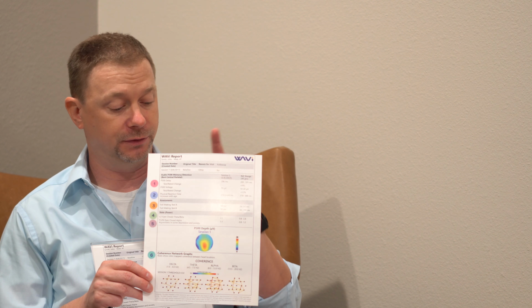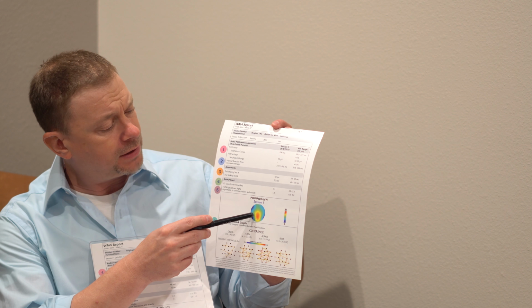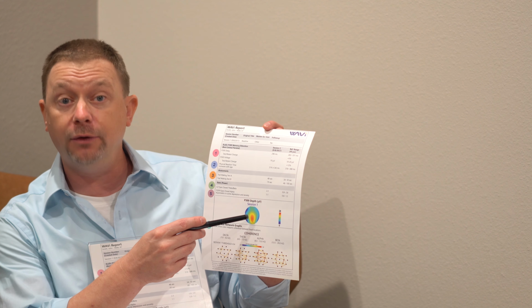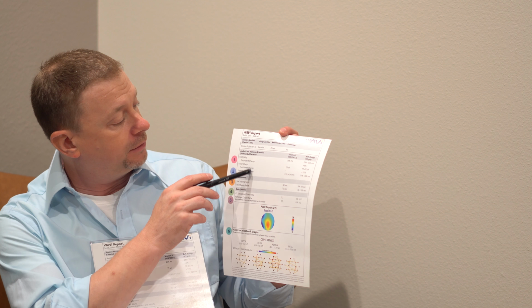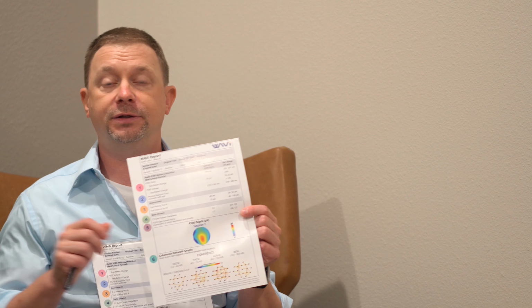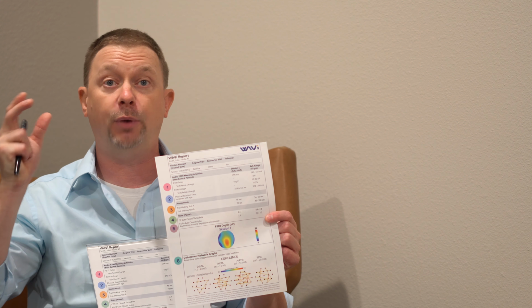While we're at it, let's take a minute and go back to the P300 values, which we haven't explained yet. We talked about where they are on the brain and how they're generated through sounds with that oddball sound, but we didn't talk about what they are. Up here we have the P300 delay and the P300 voltage. The P300 delay has to do with how long it takes you to react in your brain to hearing and recognizing that you've heard an oddball sound.